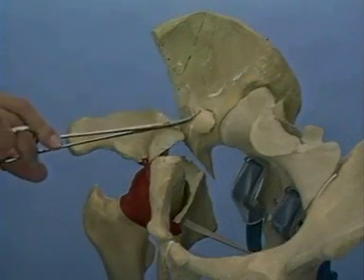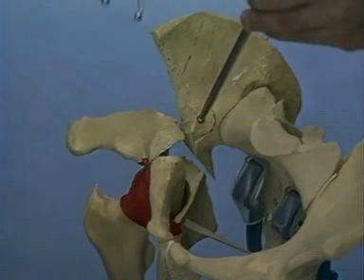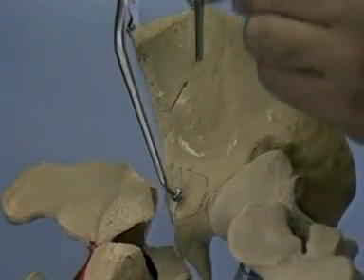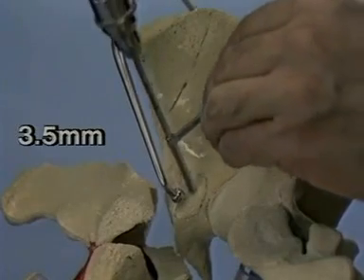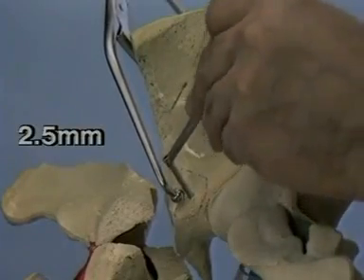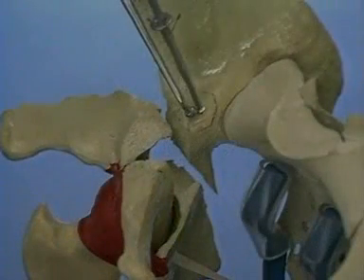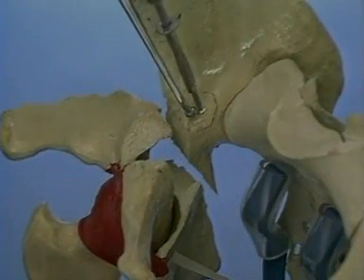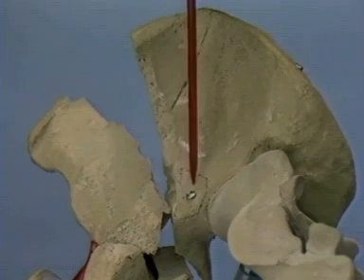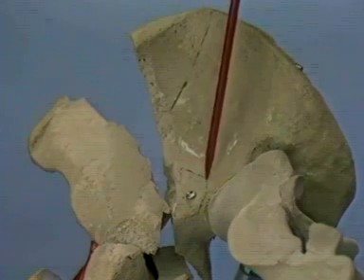The free fragment of the pelvic brim is now repositioned with the ball spike and held with reduction forceps. It is internally fixed with a 3.5 mm lag screw using the 3.5 mm drill bit followed by the 2.5 mm drill bit. After measuring the depth, the screw is inserted.